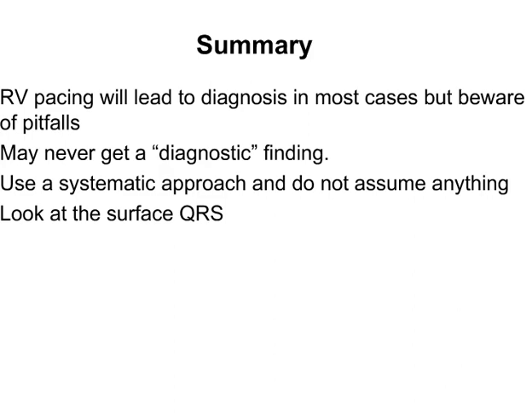Pace the ventricle, looking for atypical forms of AV node reentry. You have to be kind of stubborn and do a lot of pacing sometimes to get AV node reentry to go. But I've spent literally 30 minutes or more doing nothing but pacing, trying to get patients into AVNRT. And then when they finally go, they go, and they become incessant frequently. But it can be very stubborn. And I think you need to use isoproterenol, even though it's the most expensive drug on the planet.